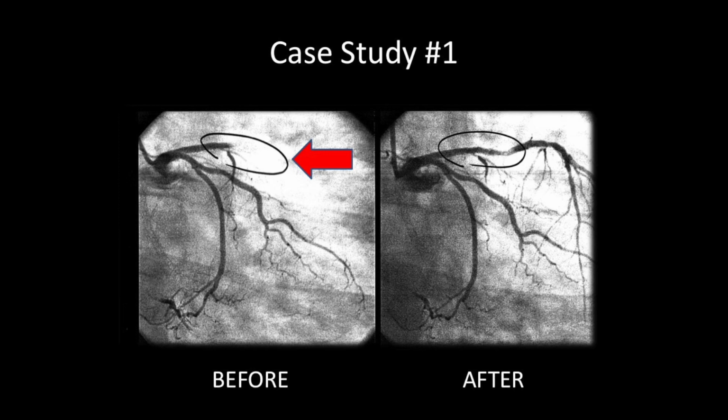They go in and they open it up and see now all this blood flow. So what you see in black, what they do is they go to the opening in the aorta, and there's an opening there into the coronary. So two coronary openings still, and I put my catheter right there, and then I start squirting dye into it. And that dye is what makes this look black. And as I squirt the dye in, the film runs, so I actually see it moving through the artery. It's awesome. If you ever get to see it, it's really cool.